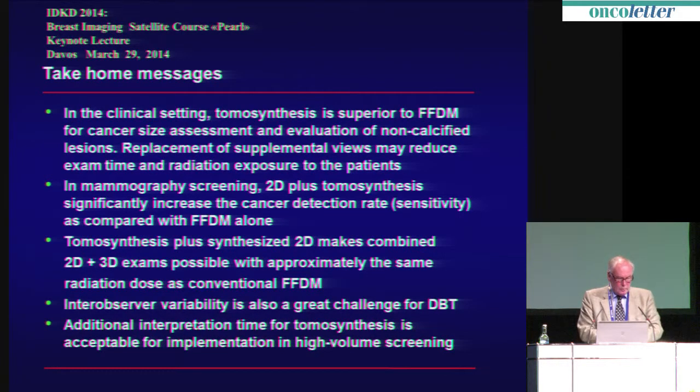So to you all, take-home messages. In the clinical setting, I think tomosynthesis has proven superior to conventional FFDM for cancer size assessment, assessment of multifocality, and the evaluation of non-calcified lesions.